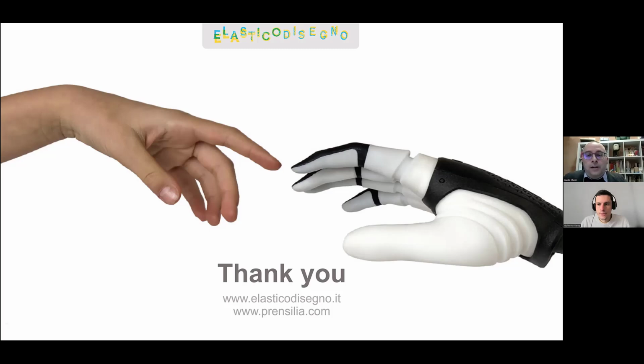So that was very rewarding. So we're still working because the hand being 3D printed allows the Prensilia to introduce changes and adjustments on the go. I mean, every single one can be different from the previous one, meaning containing improvements every time. And one of the areas we've been working on with them are the fingers, which in the picture here we see that the black part is 3D printed, it's plastic, and this white portion is molded in silicon on top of the plastic part.